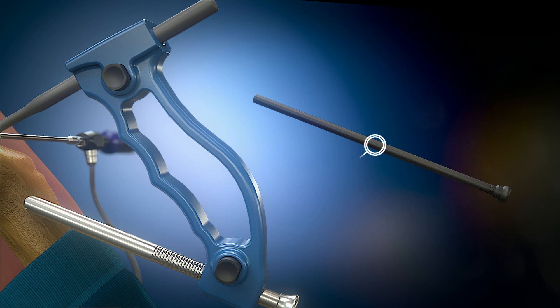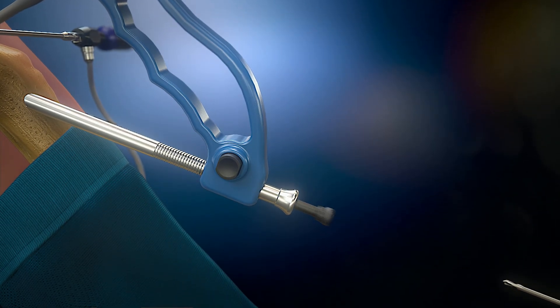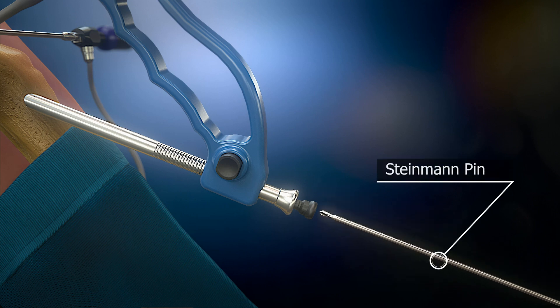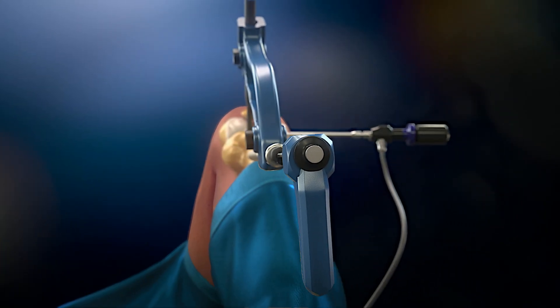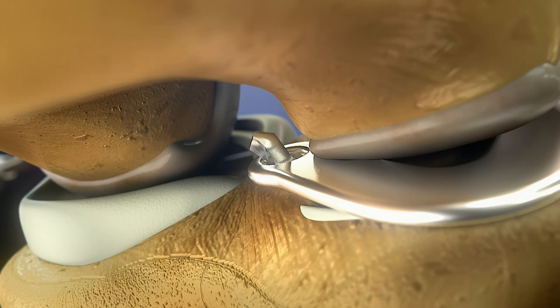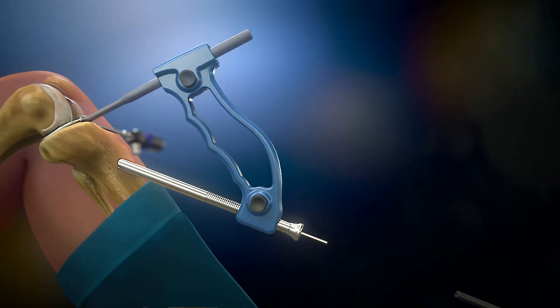The sleeve is inserted into the trophine. A 3.2 mm Steinmann pin is drilled through the sleeve into the tibia until the tip emerges above the plateau at the anatomical position of the former posterior horn of the meniscus. The sleeve is then removed and the Steinmann pin is left in place.